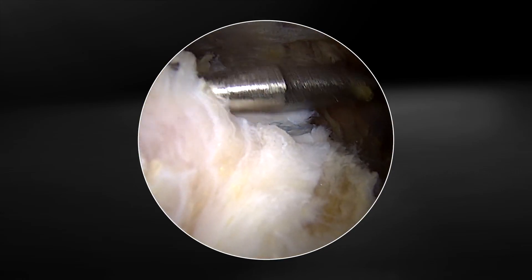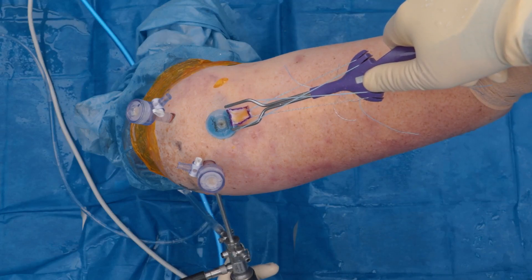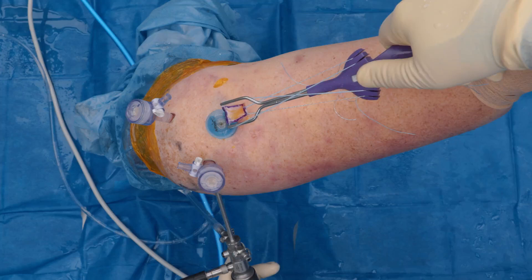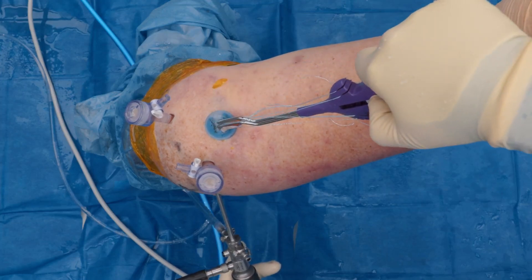You can see the anterolateral portal placed by the passport cannula here. This will allow the graft spreader with the patch to sit on top. Viewing from the outside, you can see the graft in the graft spreader is prepared nicely, and then all we have to do to insert it is simply slide the wheel back, which allows us to enter into the passport.